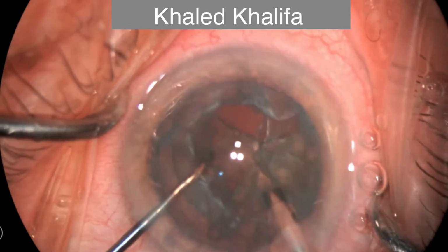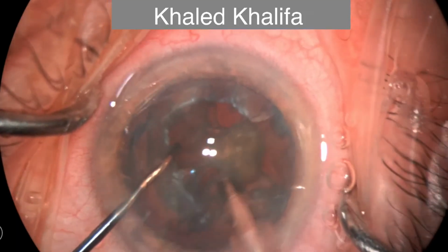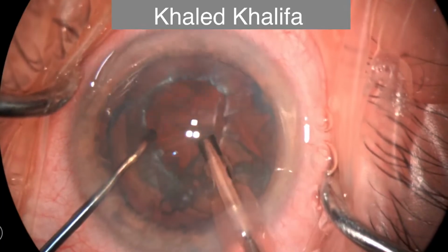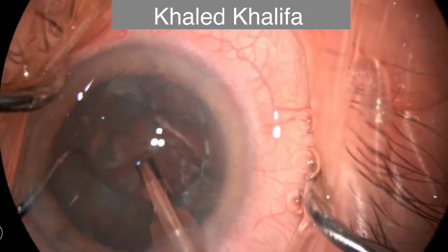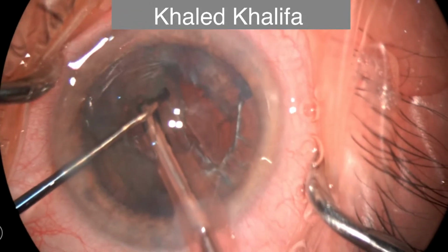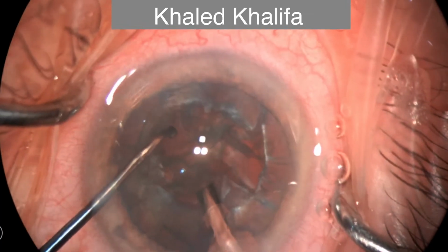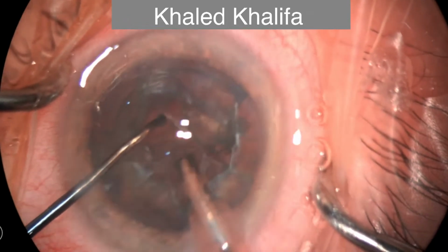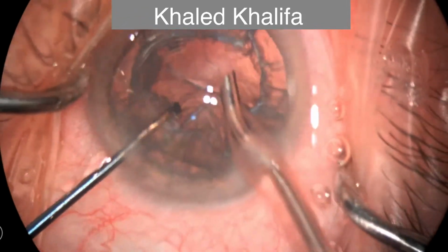from behind. But at the same time, I don't like to elevate the bottle more because elevation of the bottle in such cases may cause a posterior direction of the BSS, so I keep my fluidics the same and I just release the speculum a little bit and decrease the size of the nuclear materials to be able to emulsify inside the bag.